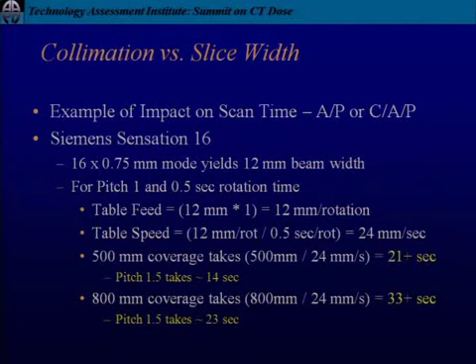But we'll get the thin slices if we need them. And 23 seconds if we go through the chest first, abdomen. By the time we get down to the pelvis, maybe you can have the patient relax. Depends on what you need. They can exhale. You'd prefer not, but that's some of the constraints, right?